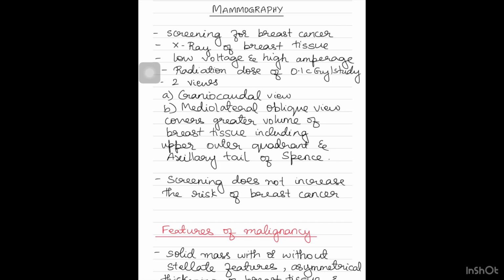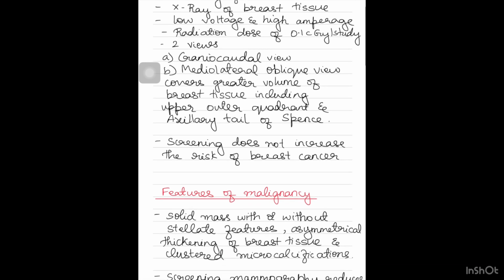There are two views, craniocaudal view and mediolateral oblique view, which cover the greater volume of the breast tissue including the upper outer quadrant and axillary tail of Spence. And this screening procedure is done every year for patients who are above 40 years, and this radiation exposure will not increase the risk of breast cancer.